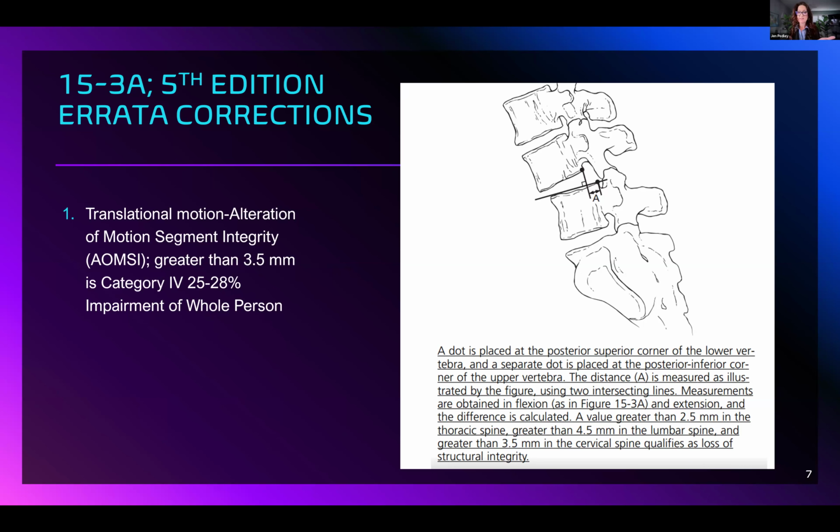Even in this diagram, I could go even more in depth on this segment. We have anterior disc wedging and splaying apart of the spinous processes, which we're going to talk about next. Sometimes there are combinations going on at the same time, and we have to put all the pieces of the puzzle together. That is not going to happen with some of these generalized radiology reports.